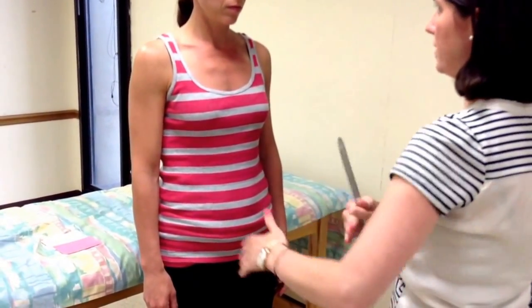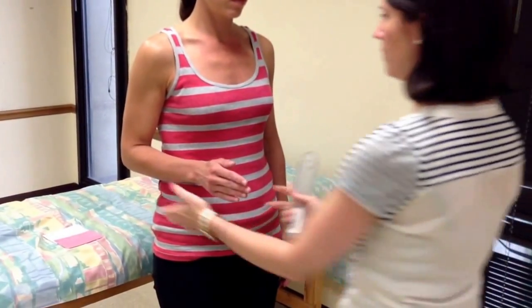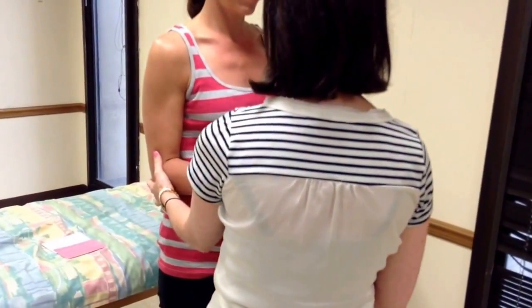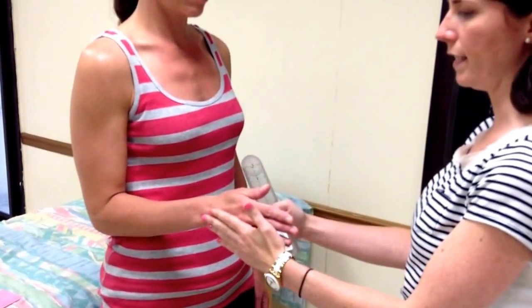The patient can be either standing or sitting — it doesn't matter. The patient is going to be at zero degrees of shoulder abduction and 90 degrees of elbow flexion. Just bring your elbow forward a little bit. She's starting in forearm neutral, thumb up to the ceiling.